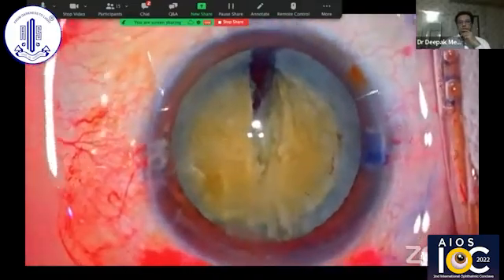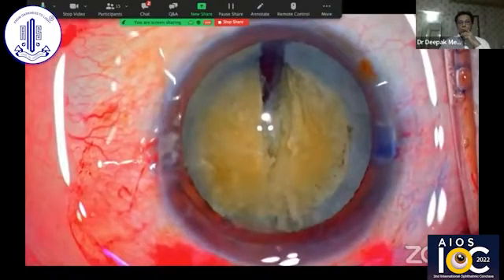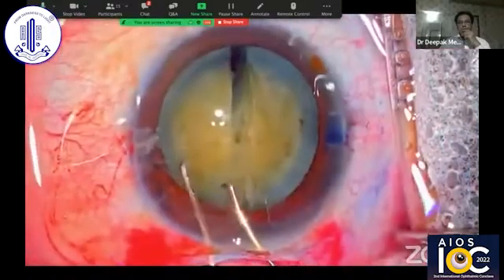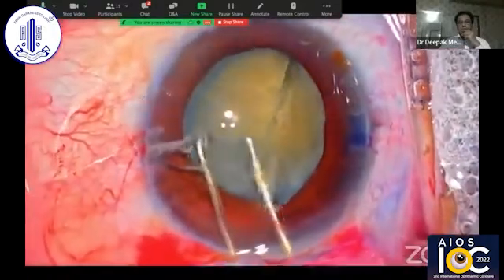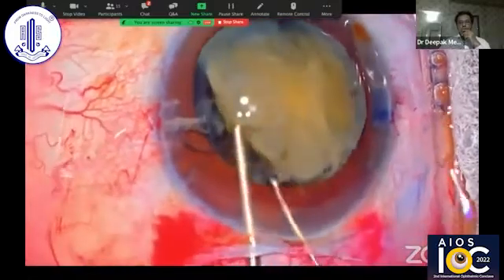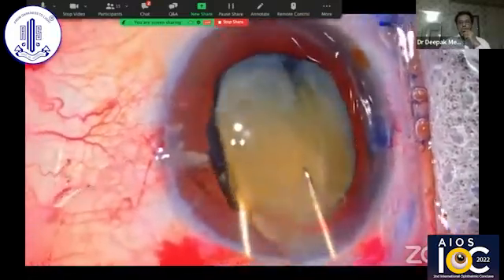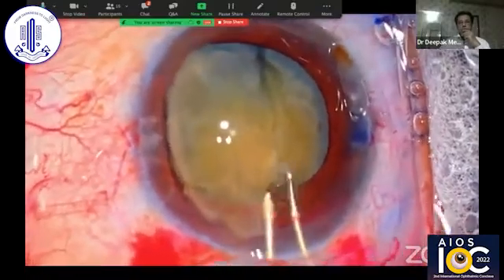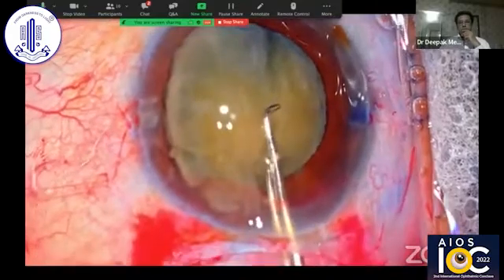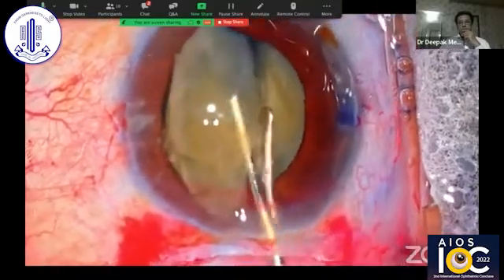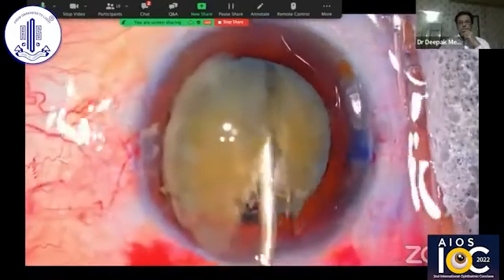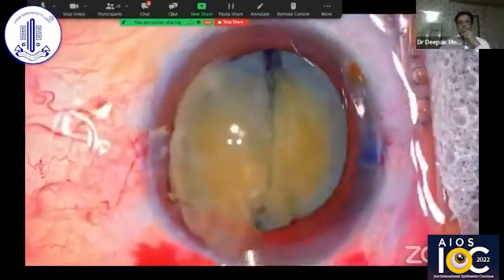Now is the time to prolapse each hemi-nucleus out of the bag and extract them out of the eye. Using two Sinskey hooks, I try to manipulate one hemi-nucleus out of the bag. I realize there are still some fine attachments ensuring the other hemi-nucleus is also trying to come out a little bit. A little manipulation of the two Sinskey hooks followed by OVD injection ensures that the two hemi-nuclei are separated.